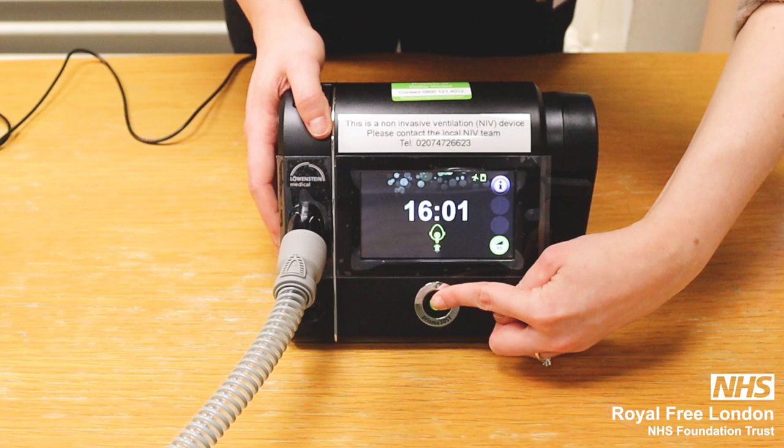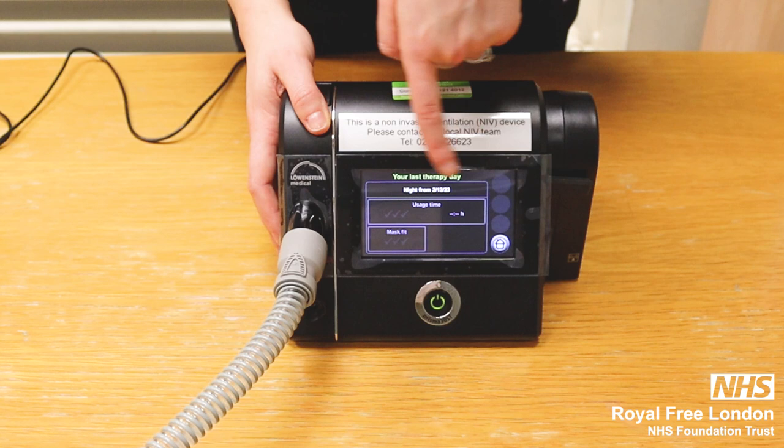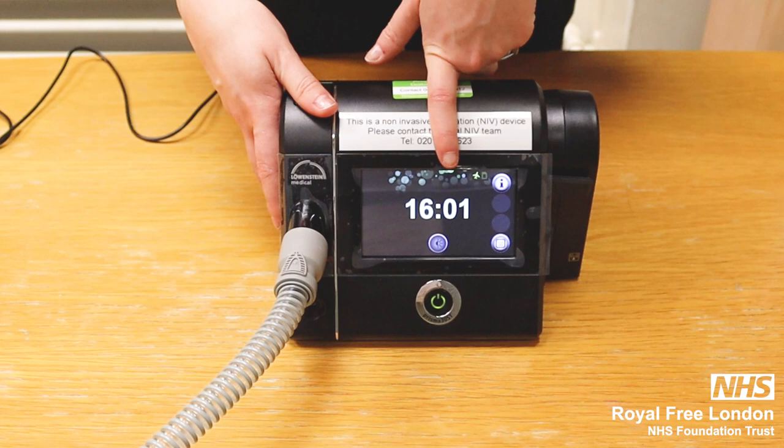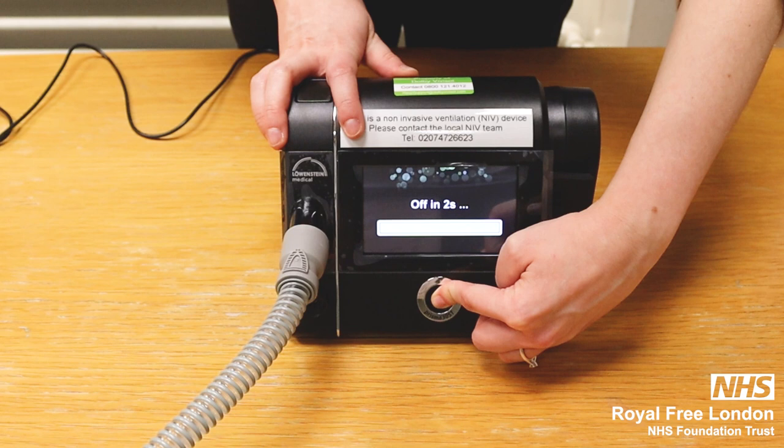To switch off the device, press this button and it will go to standby mode. It will go back to the home screen, show you the usage time and the mask fit, and then return to standby mode. If you need to switch off the machine completely, keep pressing this button and it will go off in two seconds.